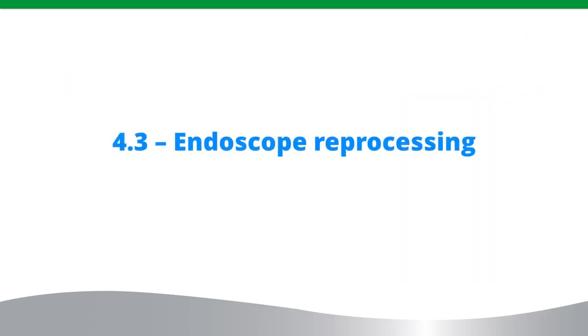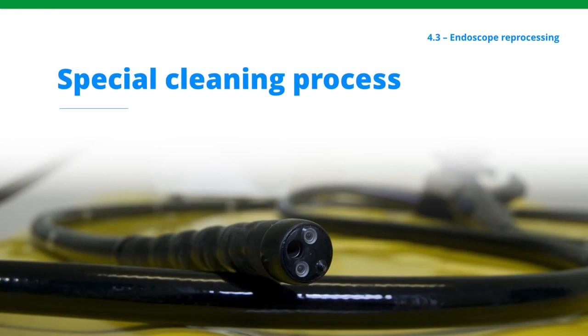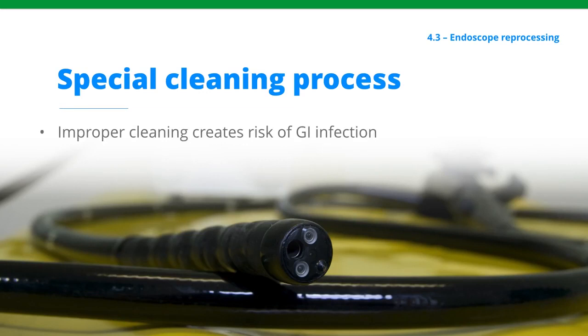As mentioned earlier, endoscopes and other internal examination instruments present a high risk of cross-contamination due to their close contact with body fluids and pathogens. It is therefore imperative to make sure these are fully cleaned and disinfected before reuse. Improper endoscope cleaning presents a high risk of transmission of gastrointestinal infection. For example, strangles caused by Streptococcus equi is serious and affects horses treated with a respiratory tract endoscope which may be infected with the bacterium.